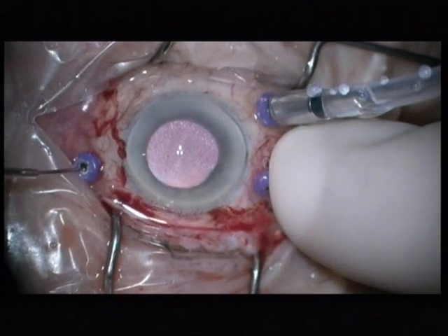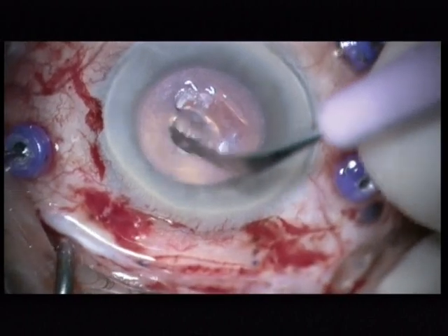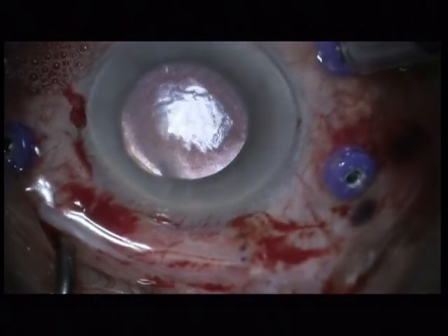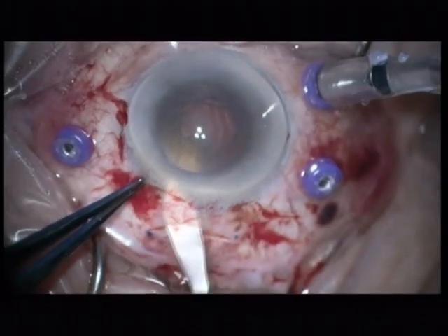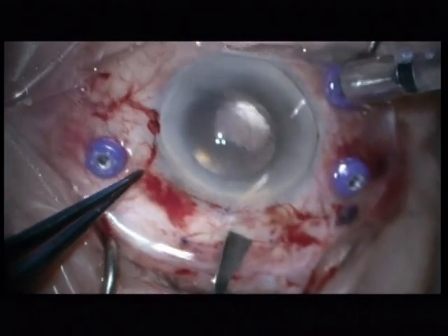Now I will examine the fundus, and the view to the fundus is very poor, but you can see an Ozurdex pellet and a dislocated IOL. I'll perform an abrasion of the cornea to improve the view to the fundus, and now you see clearly a dislocated IOL and an Ozurdex pellet on the posterior pole. So the aim will be to remove both items.